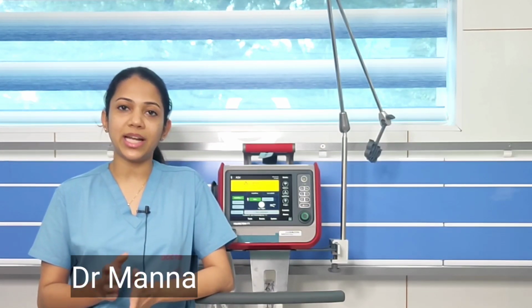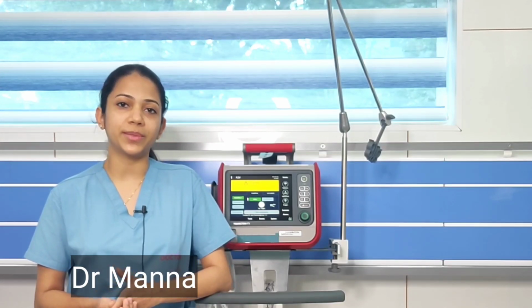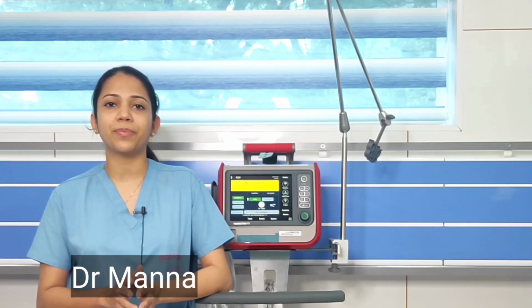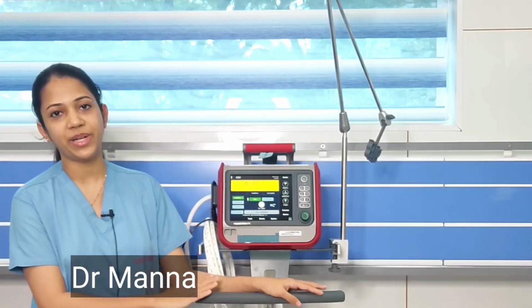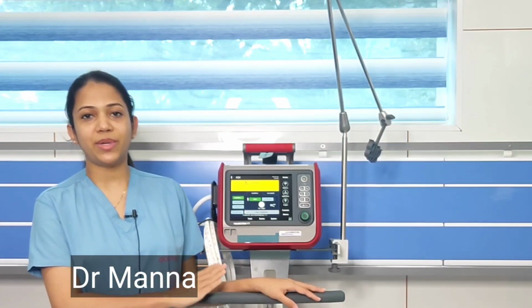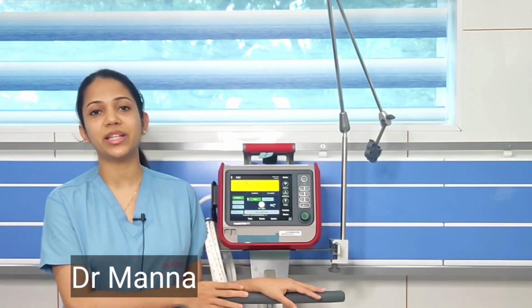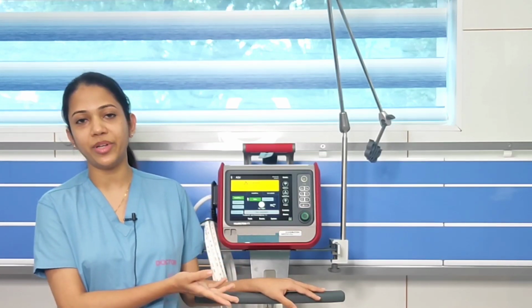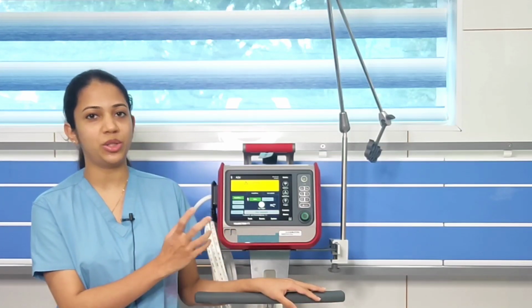So there are different types of trigger: time trigger, pressure trigger, volume trigger, and flow trigger. Some basic settings are time trigger. That means we will be setting a respiratory rate. Depending on that respiratory rate, the ventilator will be triggering the breath, not the patient. The ventilator will not be sensing the patient's respiratory effort.